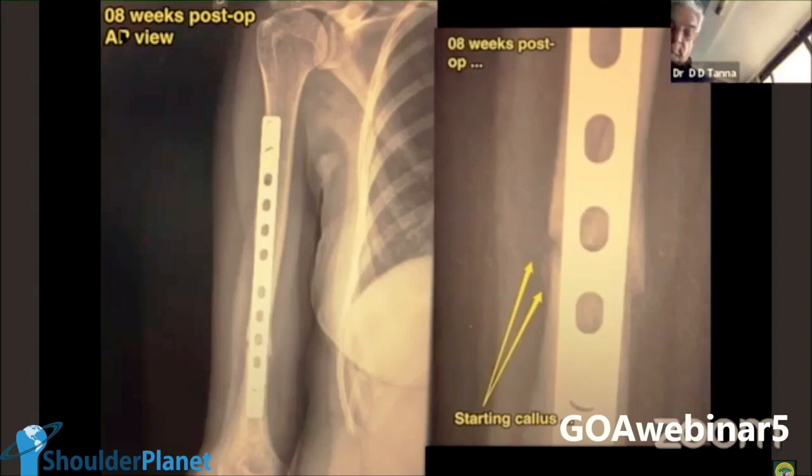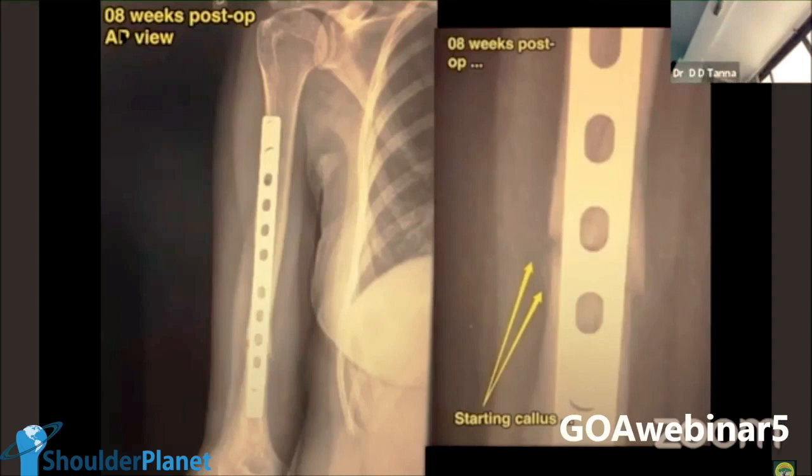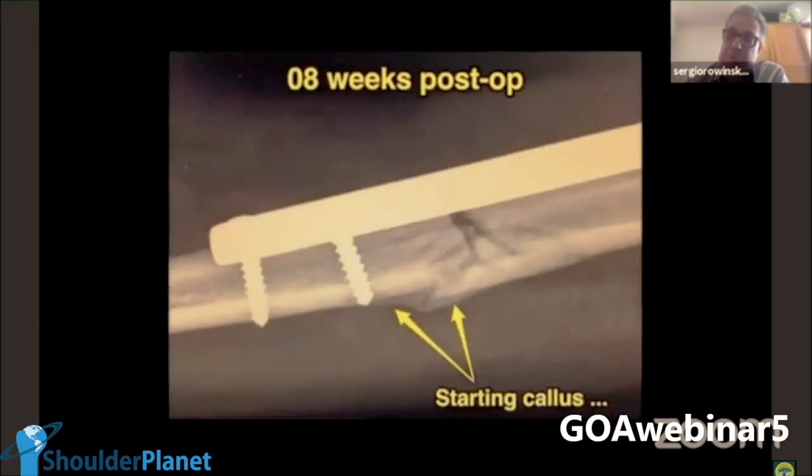In my opinion, it depends on the age, because this is a biological technique in which you need a lot of biological response. So this girl, you see, at 8 weeks already has a beautiful callus, but this is not the average. This is happening because she's very young, in my point of view. At 5 weeks post-op, she was wonderful, and when you come to 8 weeks, you have the starting callus, but this is not the average.